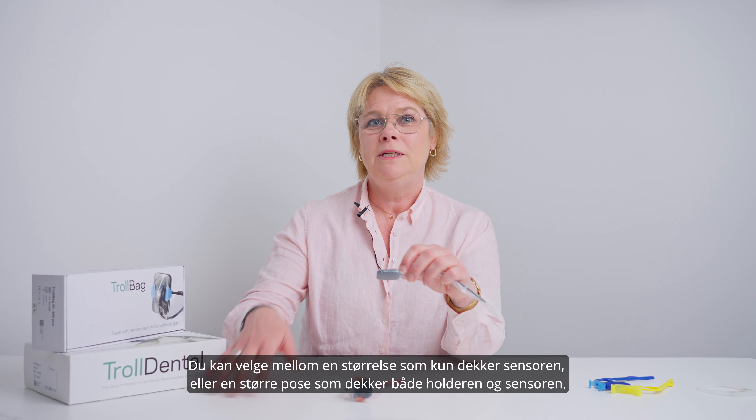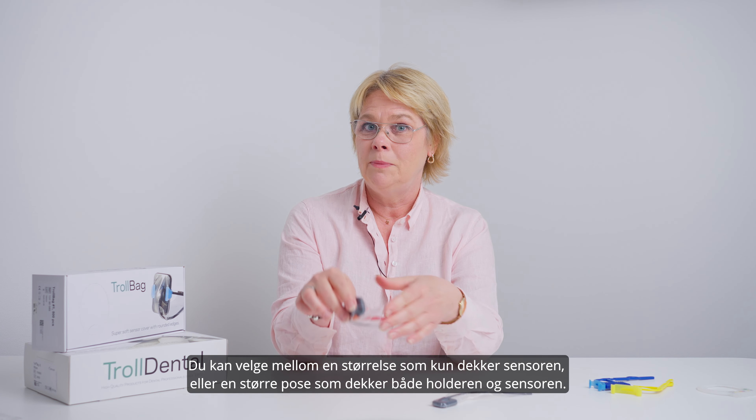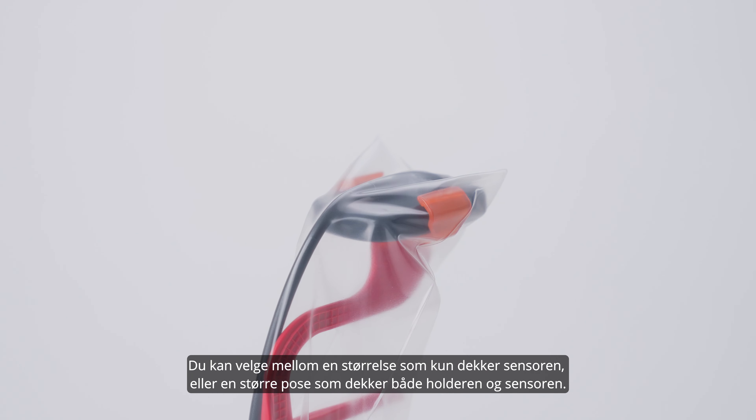You can choose between a size that covers directly on the sensor, or a larger bag that covers both the holder and the sensor.